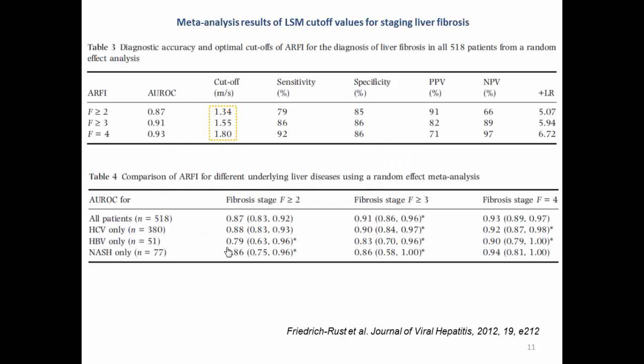And for clinical application, it will be useful if we can figure out some cutoff values for differentiation between the normal liver and liver fibrosis or cirrhosis.